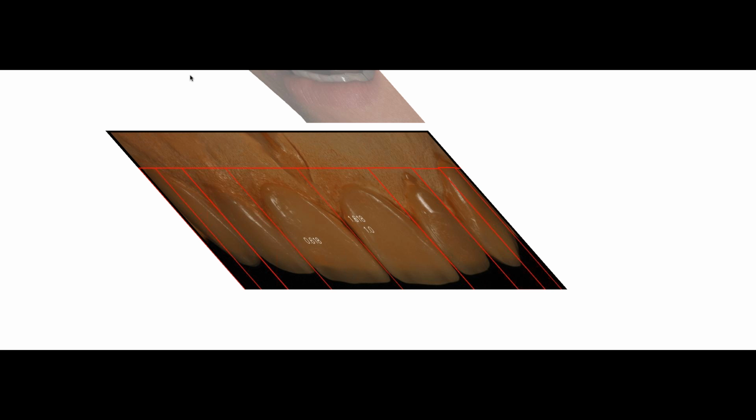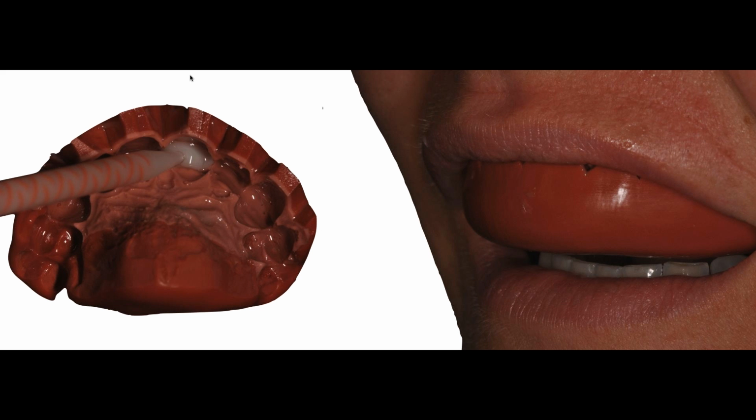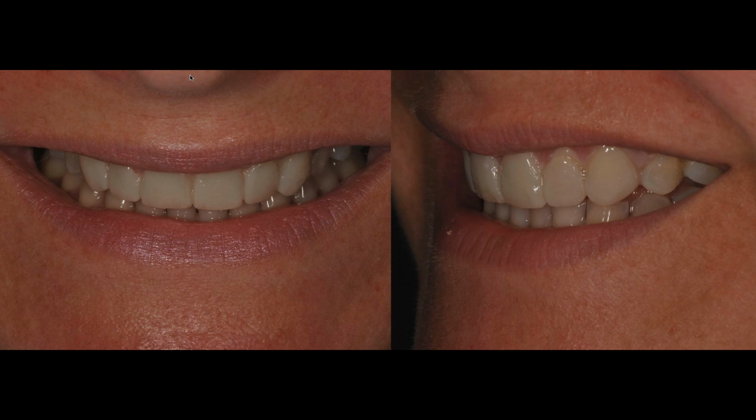So when the patient comes back to our practice, now we have all this information, and we're going to get another set of photos. We take an impression and obtain a putty matrix from our wax-up, with all the photos, the digital smile design and the wax-ups. We do both a putty and a light body impression material, so that we copy in a very detailed way every single detail that we placed into our wax-up. That now goes into our patient's mouth, and this is what we call the aesthetic mock-up.